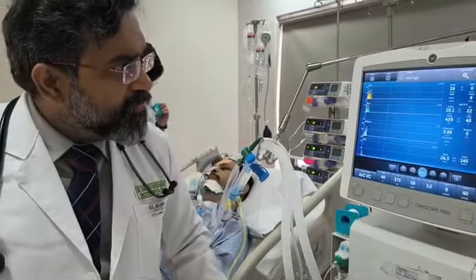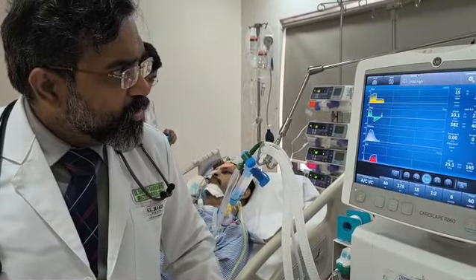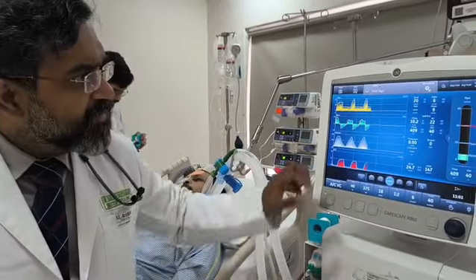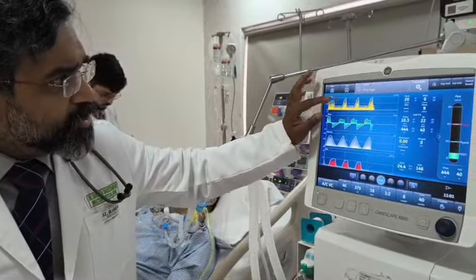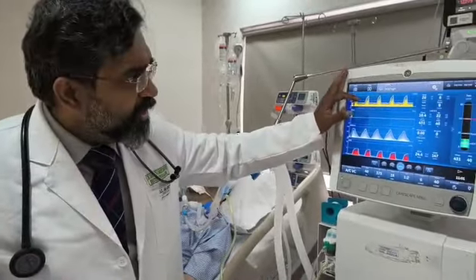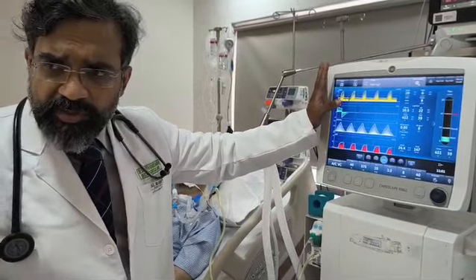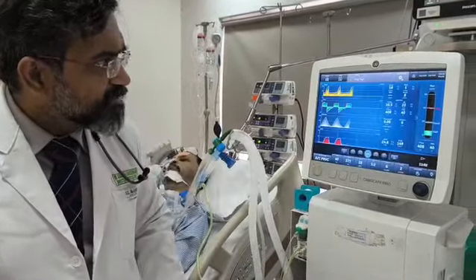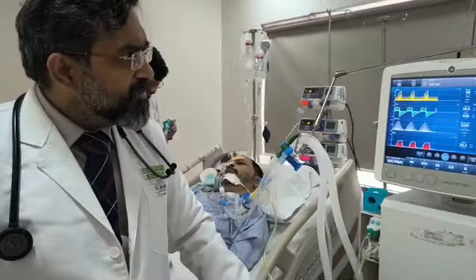Okay, so let's see. We go to confirm volume control. It's gone to volume control mode. There's no more flow artifact here. However, we do see that there is no trigger delay, but there is air hunger. The reason the patient is on PRVC is because we want to get off this air hunger, which might cause later problems. That's why we go to PRVC here, which reduces the air hunger situation. Okay? Alright.